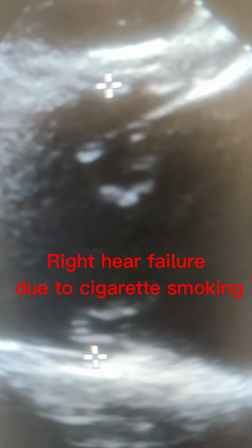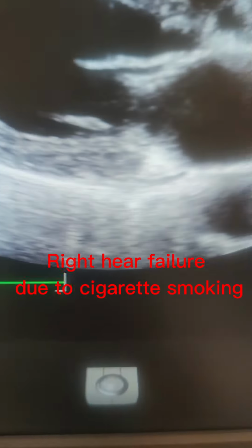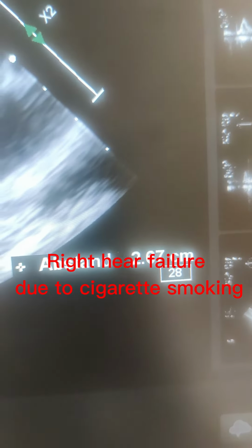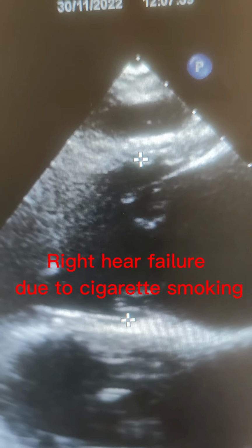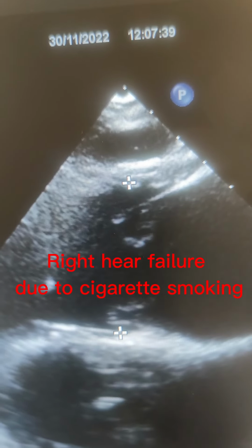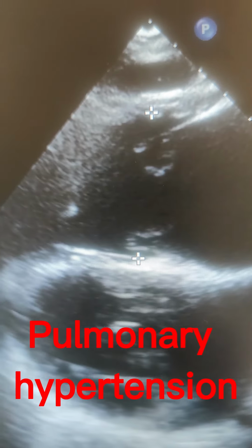When I measured the diameter of the right ventricle, I got 4.2 centimeters, which in the case of that normal patient was just, what is it? 2.6 centimeters. The actual normal is only 3.4. But this patient that is sick with shortness of breath, chest pain, and leg swelling has a 4.2 centimeter diameter of the right ventricle. That is not normal at all.